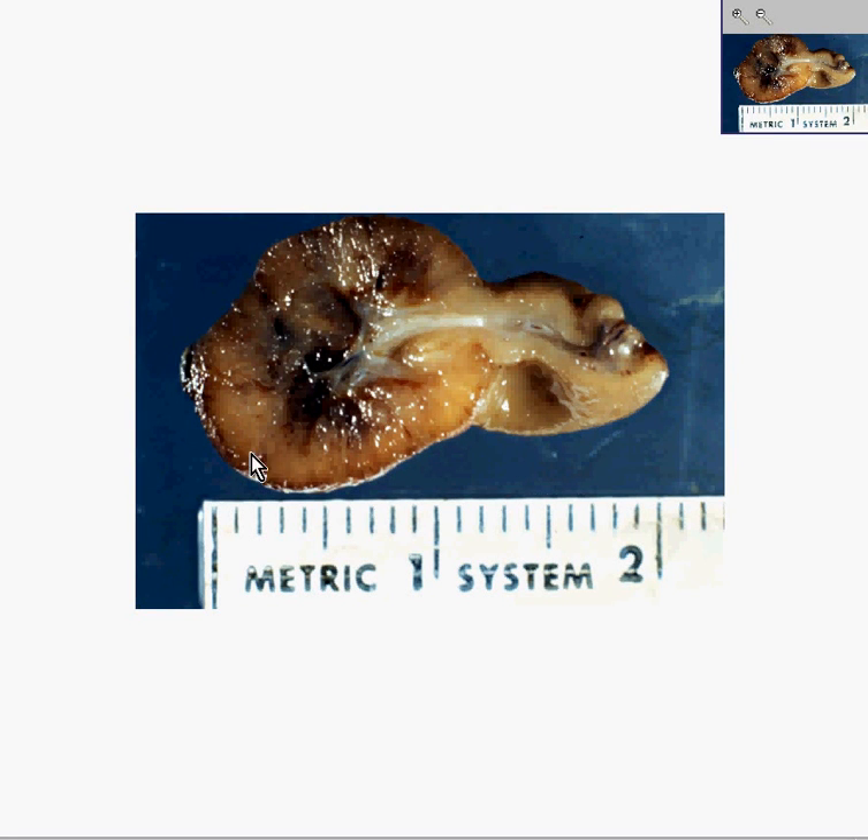Here is another polyp of the colon, in which you can see here is the stalk of the polyp. Here is the connective and vascular tissue. Here are the glandular areas. And here is precisely the stalk. It looks like the mucosal surfacing of this stalk also is a fairly normal, uniform colonic mucosa.